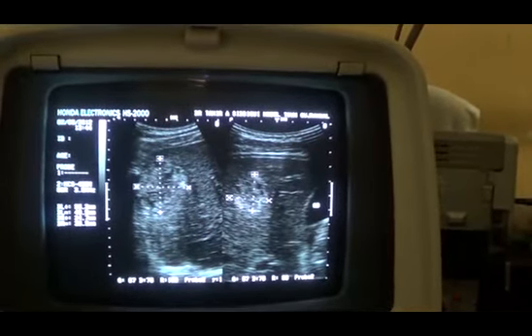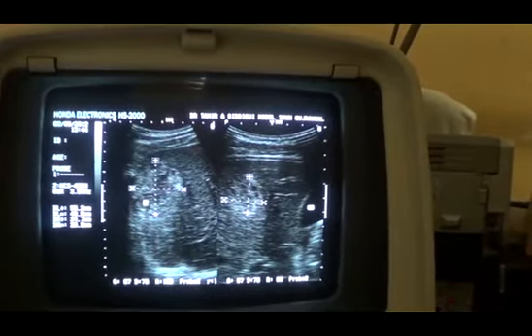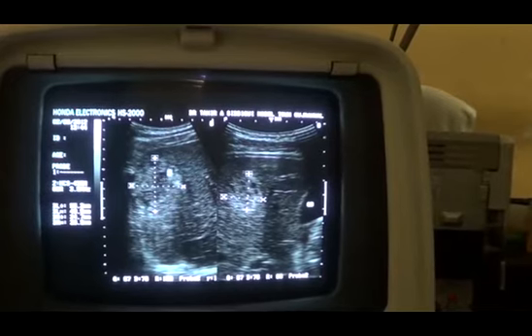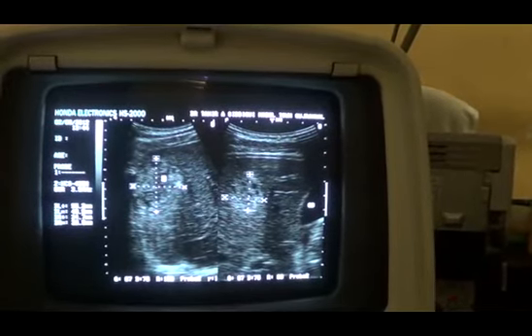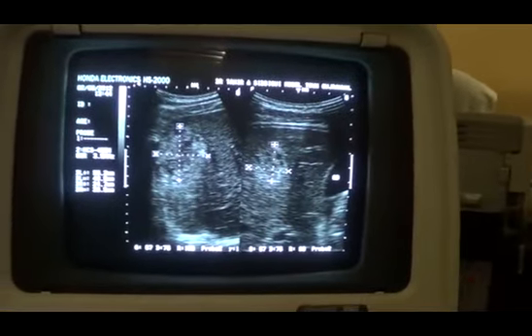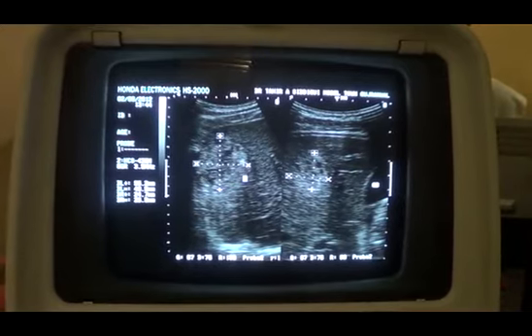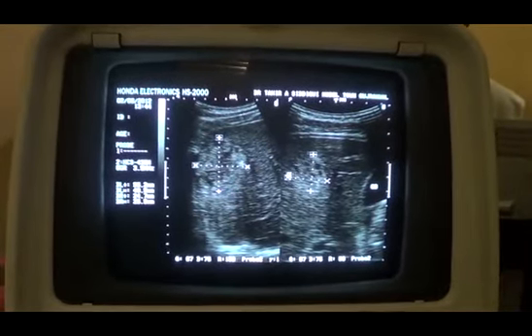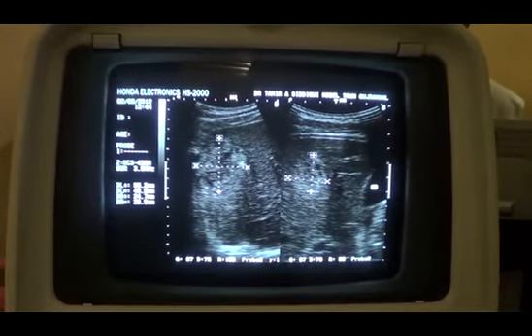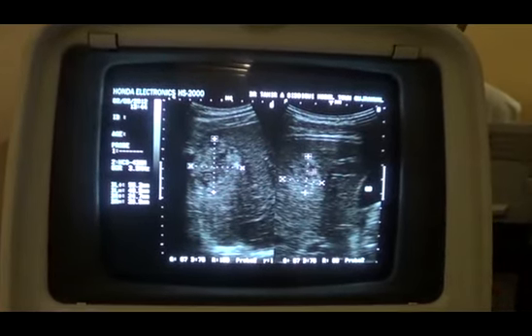This is the solid focal mass lesion. This is the solid echogenic, coarse echogenic focal mass lesion with internal tiny cystic areas. There are multiple, 1, 2, 3, 4 are seen in this scanning plane, whereas in this you can see these are tiny cystic areas, all of these.